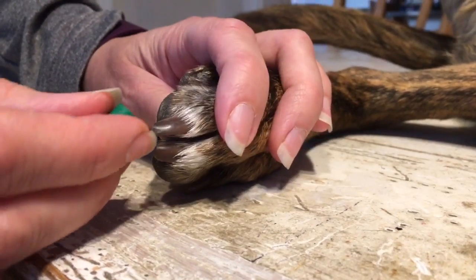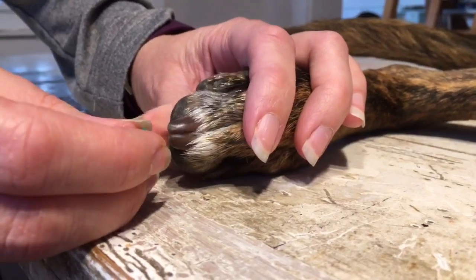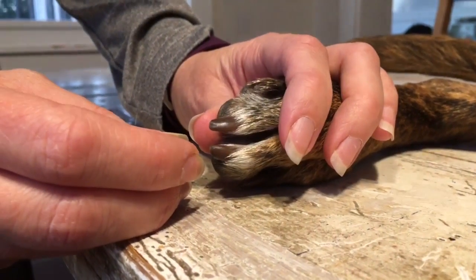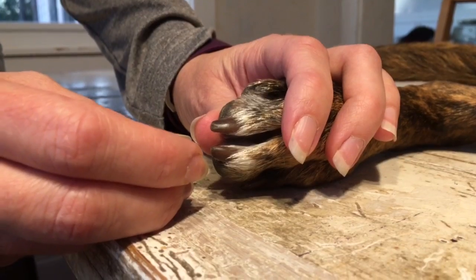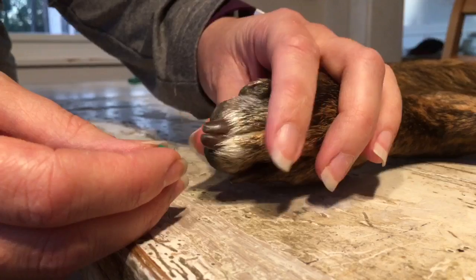When applying toe grips, the directions say that you're going to slide the grip up the nail. I've come to realize that that language may not be accurate in every situation. There is some degree of effort in getting this toe grip worked up the nail, and I want to demonstrate that now.